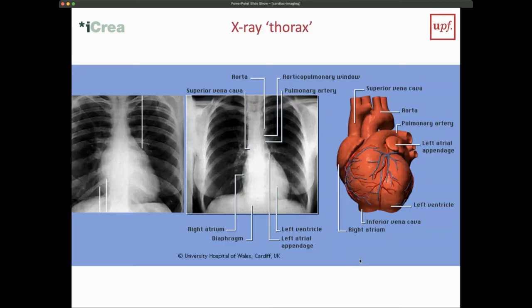So let's start with X-ray imaging. The regular X-ray thorax imaging, as we are used to, is still used in cardiology because it gives us a quick overview of what the heart looks like. This is not used in regular diagnostics of the heart, but for example, in the intensive care unit, if we need a quick view of the heart, and very often also of catheters within the chest or within the heart, then we use this kind of overall view.